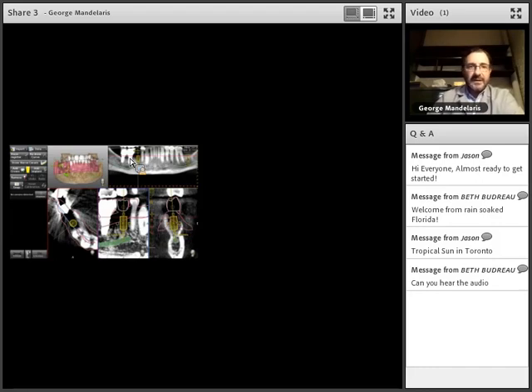From there, I'm going to trace out using the virtual tooth. I'm going to map out the mesial distal, buccolingual, and most importantly, the vertical dimension of that digital diagnostic wax up. That's what the prosthodontist or restorative dentist is telling me. That's the position that they want the teeth in. That's what I'm going to plan from. So I map out that tooth using a virtual tooth, and then I'm going to plan and place the dental implant as you see here.